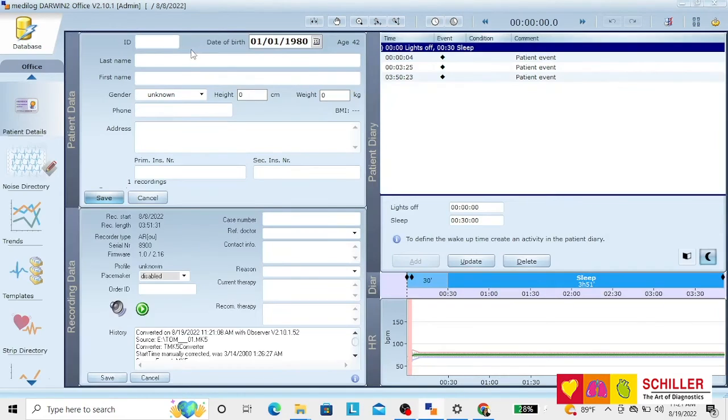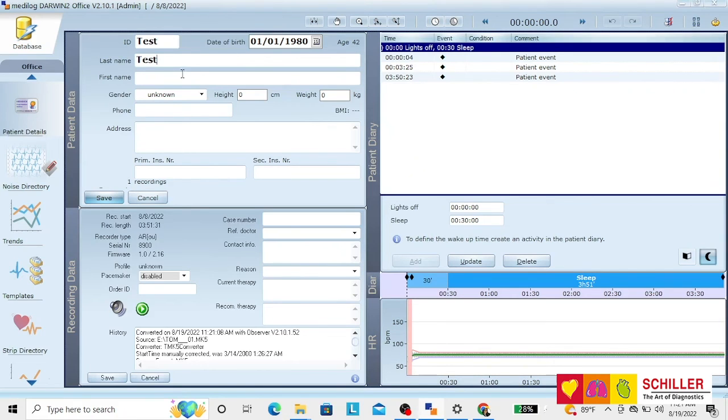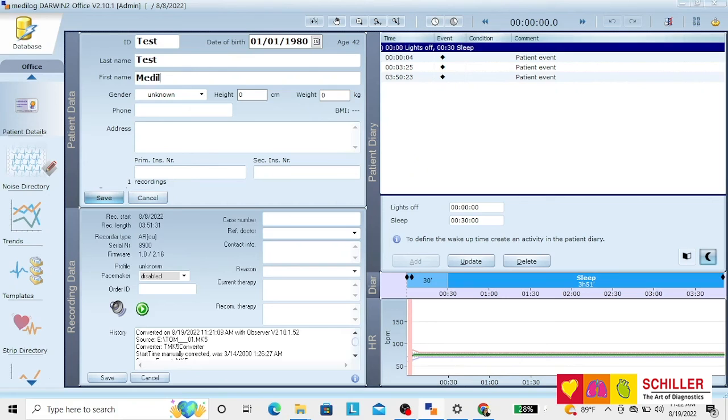Accepted. And you will have, when it opens, the possibility of putting the patient data and just save it.